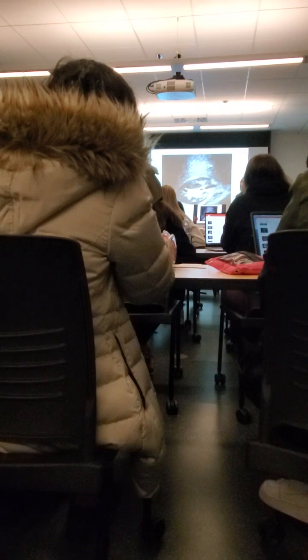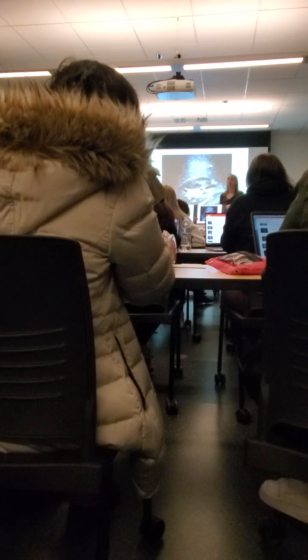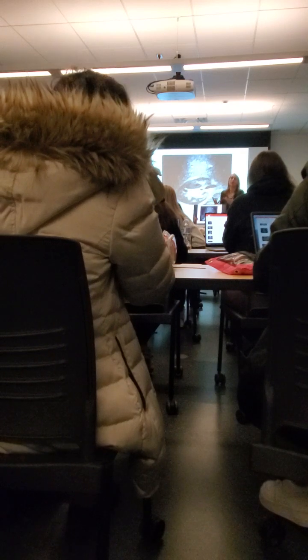To know if it's blood vessel or not blood vessel. Not so much which blood vessel, but to know, is this a dilated ureter or is it vasculature? So I'm proving one way or the other. It might be hydroureter, what we call a fluid-filled ureter, or it might just be vasculature.